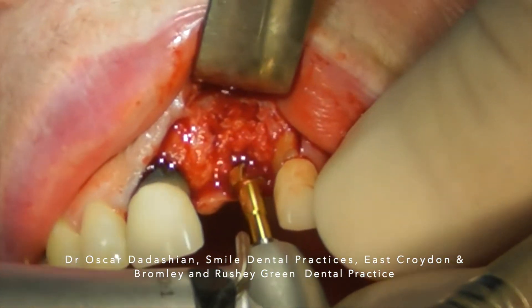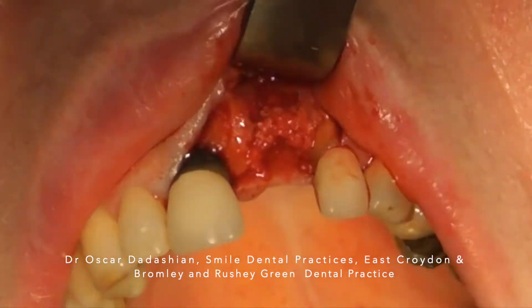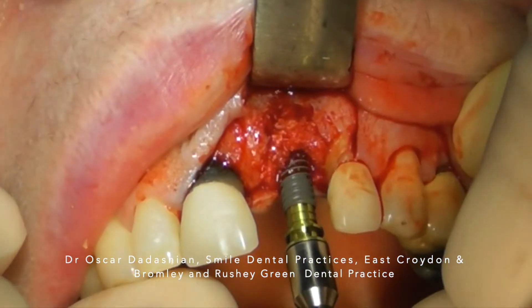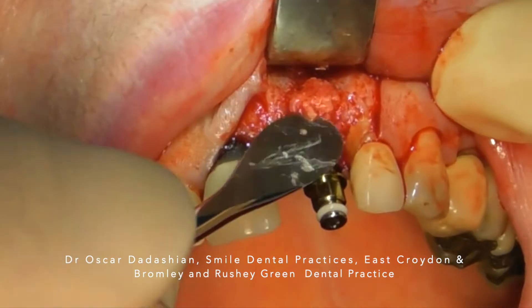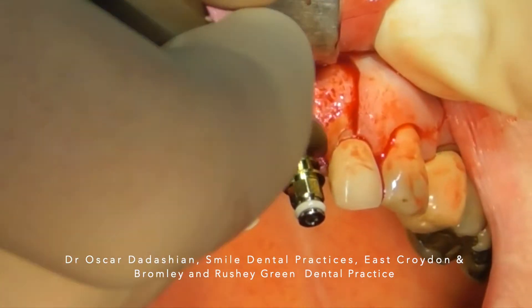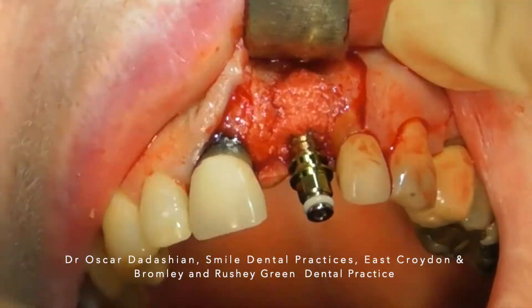As I'm preparing my osteotomy, you can see that the bone is not yet mature and it's very soft. But that's fine — as long as I get good primary stability, I can then carry on reshaping everything and create a crest.